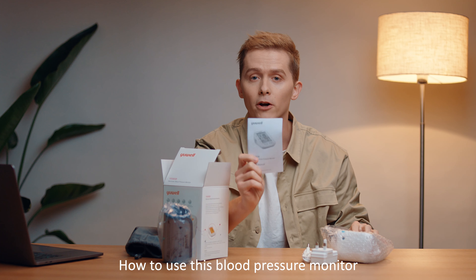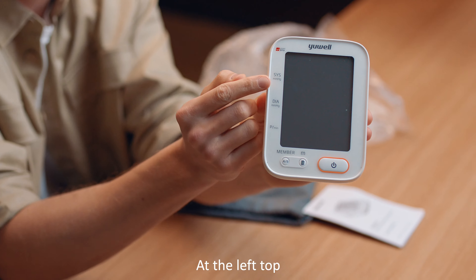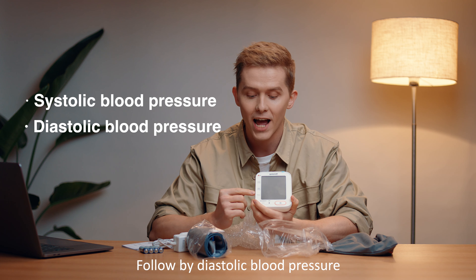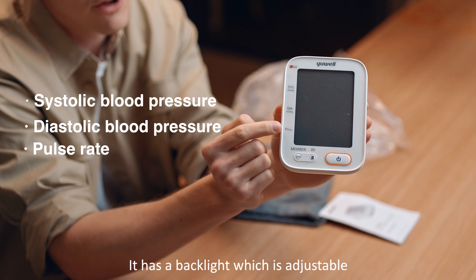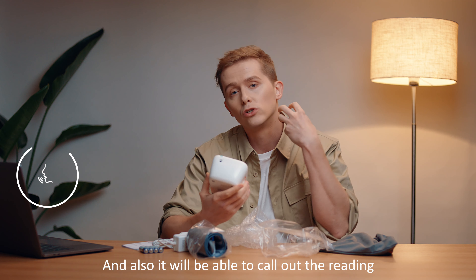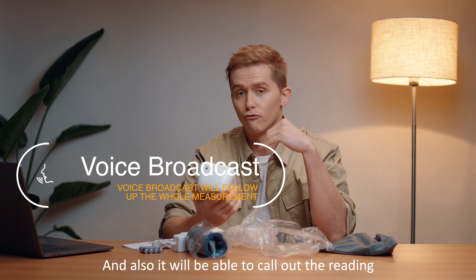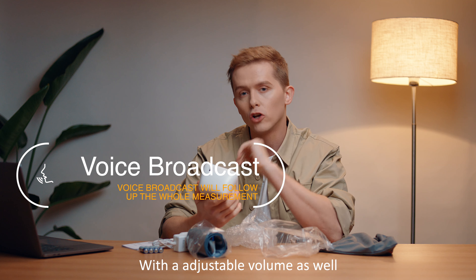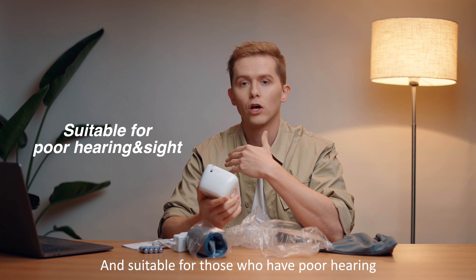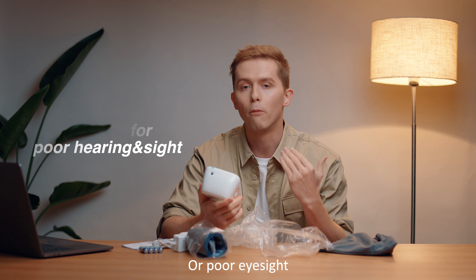The instructions will tell you exactly how to use this blood pressure monitor. At the top you have the systolic blood pressure, followed by the diastolic blood pressure, and then the pulse reading. It has an adjustable backlight and will also call out the readings with adjustable volume, making it very user-friendly and suitable for those with poor hearing or poor sight.